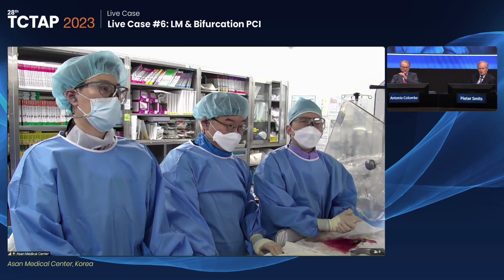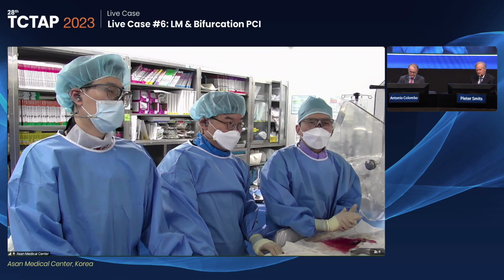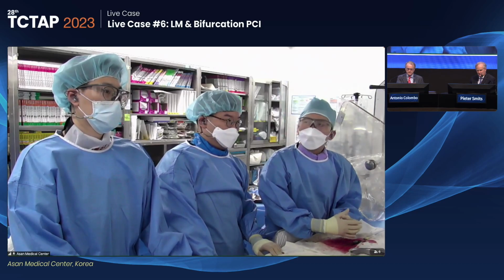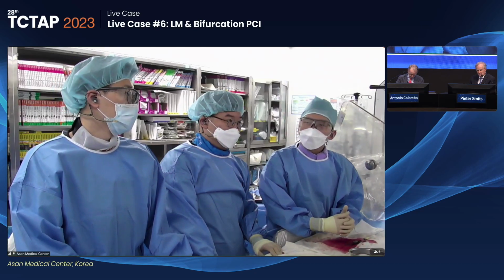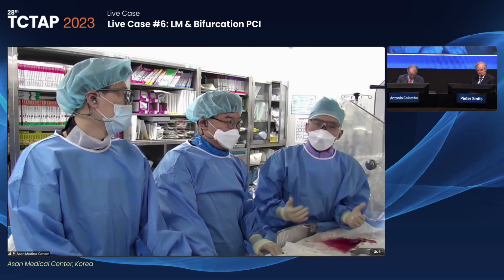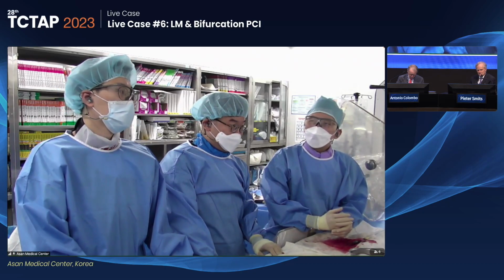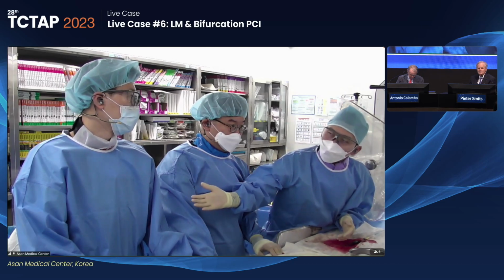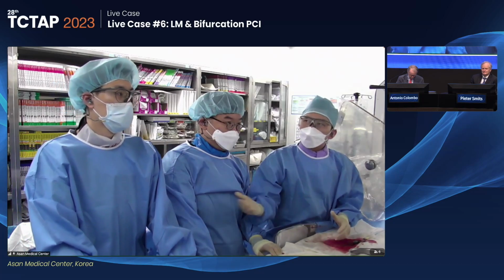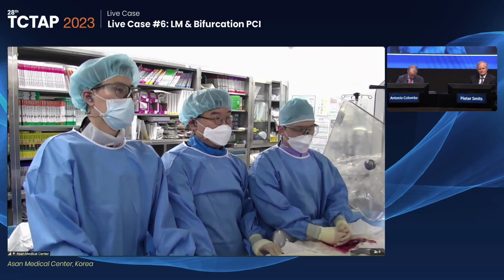Yeah. Please go ahead. Good afternoon. I'm Dr. Kang, and here is the Asan Medical Center, in the cath lab room. I will introduce our team. I'm Dr. Kang, and he is Dr. Hanbit Park from the Gangneung Asan Hospital. And he is our senior interventional fellow, Chen, and our senior technician, Kang Hyunjong, is also joining the procedure. And Dr. Chen, can you please present the case? Yes, I am Yong-Hoon, a clinical fellow.